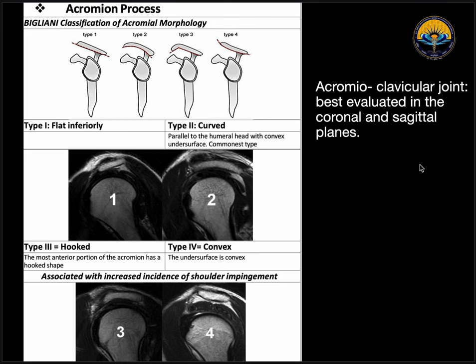Next is the acromion process. On axial sections, we can see the acromion, and based on its morphology, we have the Bigliani classification. Type 1 means the acromion is flat inferiorly. Type 2 means it is curved concavely. Type 3 means there is a hook. Type 4 means it is convexly curved. Type 2 is the most common. Types 3 and 4 are associated with increased incidence of shoulder impingement, as they cause impingement over the supraspinatus muscle.